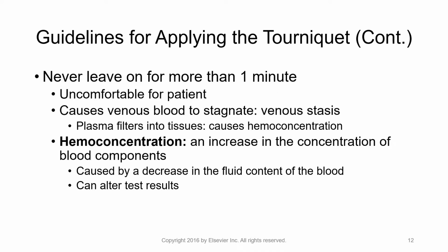Never leave the tourniquet on for longer than 1 minute. It's, for one, uncomfortable, but that's not even the important thing. It causes the venous blood to stagnate, causing venous stasis. This is when blood stays in one spot for too long.